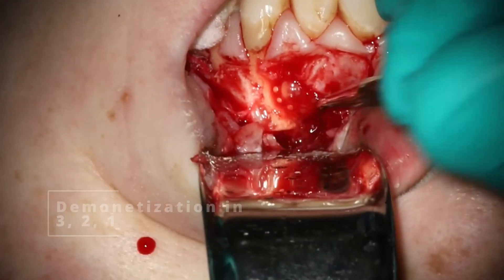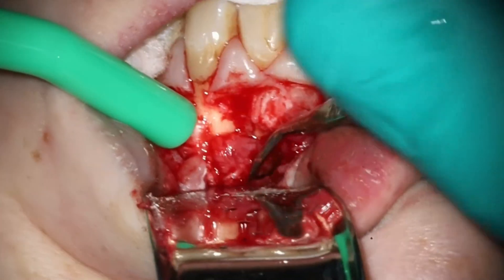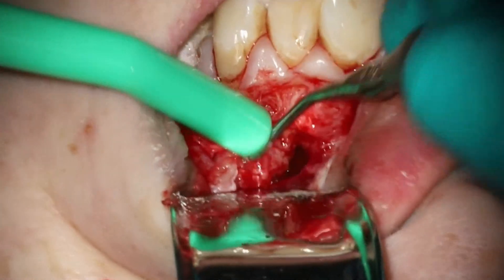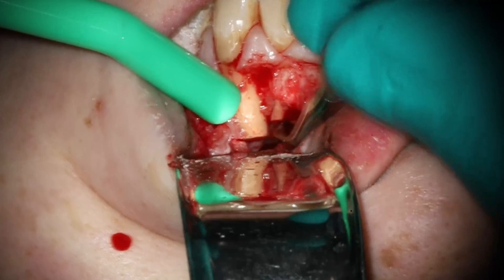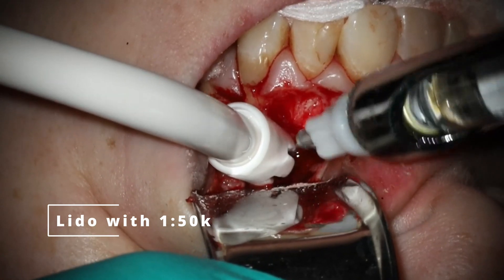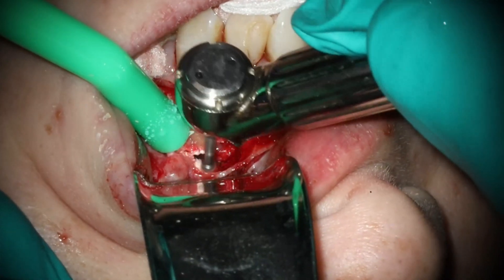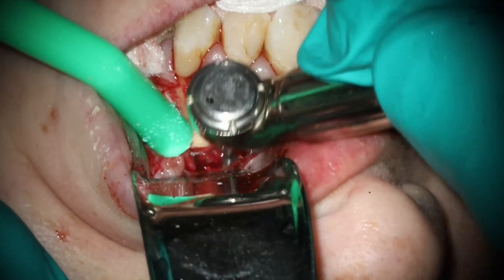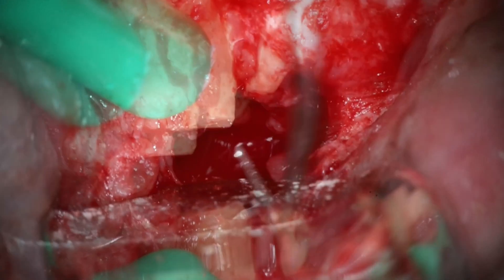You can see that lovely gush of blood because at this point we have now hit the palatal tissue. I tend to not give palatal injections initially when I do my surgeries unless I know I'm going to need to. In her case I was trying to see if I could get away without it, but she starts to wiggle a bit because she was feeling it. All my patients are sedated for surgeries, so I'm not too concerned. We're going to come in here with some anesthesia — just the 1-to-50 Lido. It gets the tissue numb and helps with bleeding. You normally don't want to inject with that on the palatal against bone because you can have necrosis from the vasoconstriction. In this case though, there is no bone against that area.